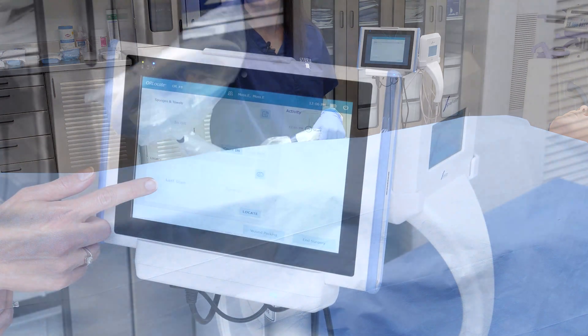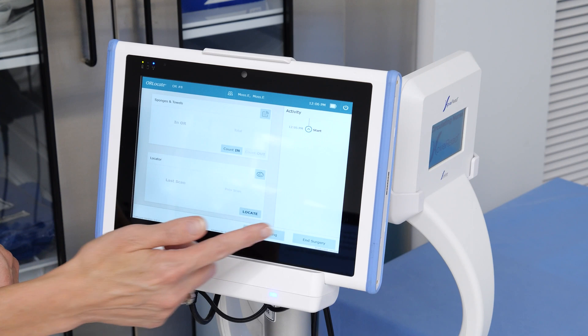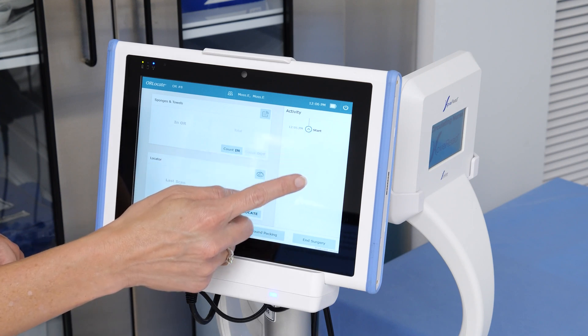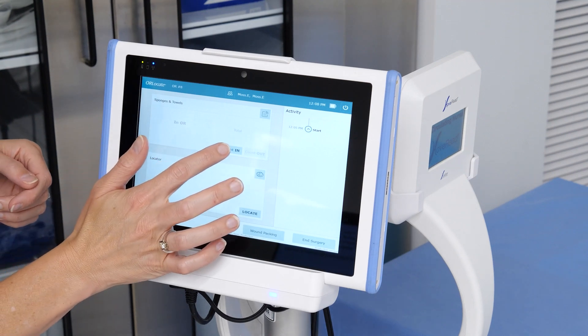The vertical window on the right is the activity window that will show all OR Locate activities that occurred throughout the surgical case. Touch the count-in button in the upper left-hand window to count in sponges or towels.